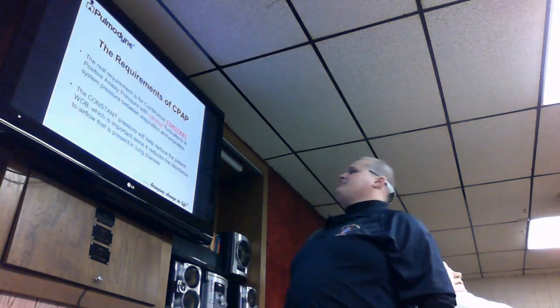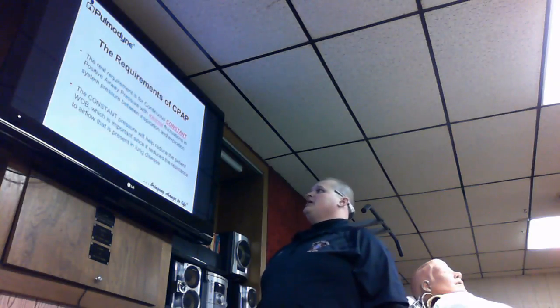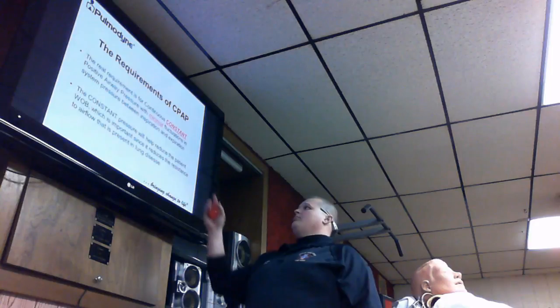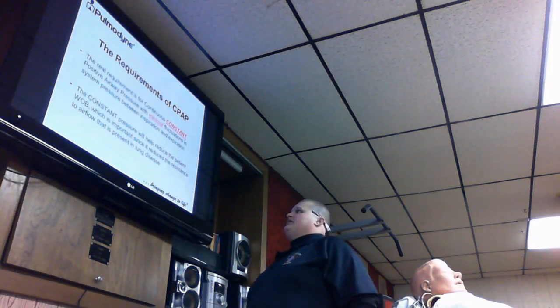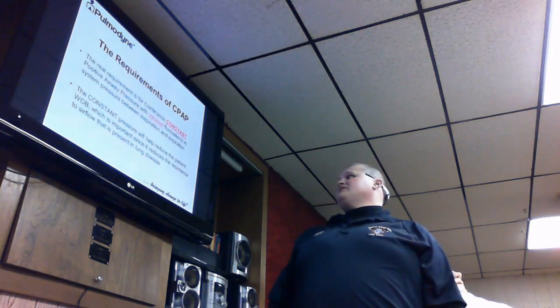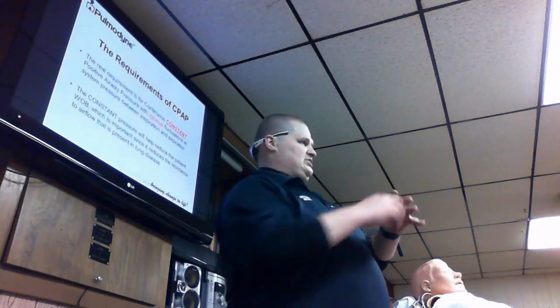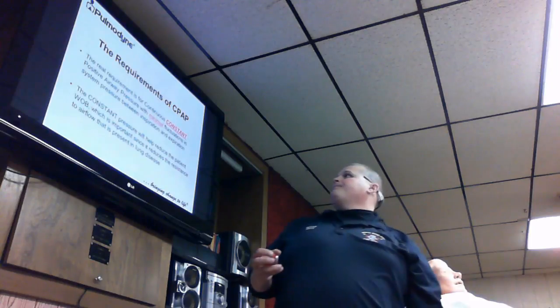So the requirements for CPAP. The real requirement is continuous positive airway pressure with minimal fluctuation in system pressure between inspiration and expiration. The constant pressure will help reduce the patient's work of breathing, which is important since it reduces the resistance of airflow in the present lung disease. Okay, so like I said, CPAP helps keep that inflation, keep that connection, and does wonders for that patient.